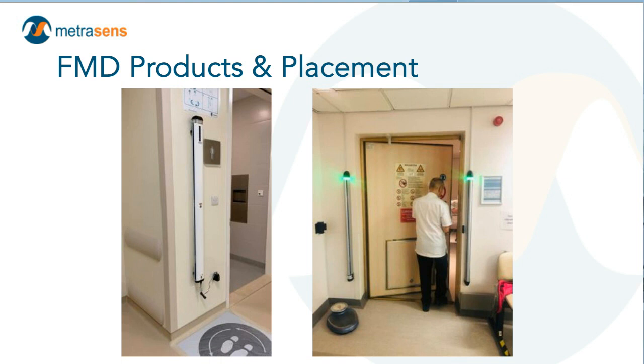The fact is that with a latching door, outward swinging doors really aren't much of a protection anyway. Swing the door whatever way you want, and relative to the last section, include overpressure relief protections. That way you have the flexibility to swing the door whatever works best for you. In my opinion, in most cases, swinging the door into the magnet room, as shown in this picture, tends to be the better, all things considered.